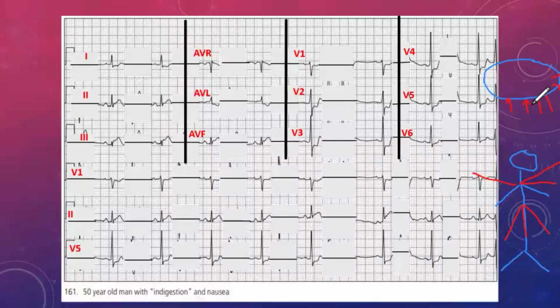It's going to take me quite some time, but anyway, let's just put it like that so that you understand. So they're looking at the heart from this point of view. Let's put our heart in there. A nice pink heart that is divided into our atria, right? Right atrium, left atrium, right ventricle, left ventricle. And remember, V1 and V2 actually look at the septum. They're called the septal leads. V3 and V4, the anterior part, and V5 and V6, the lateral part.